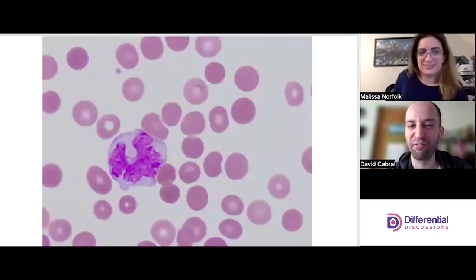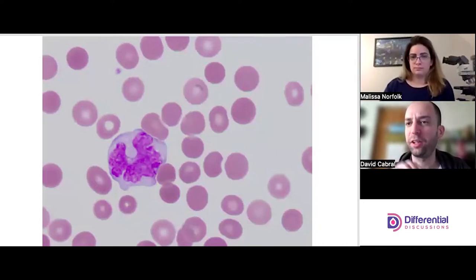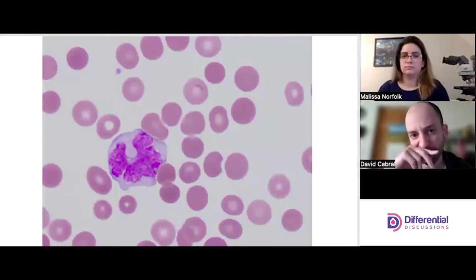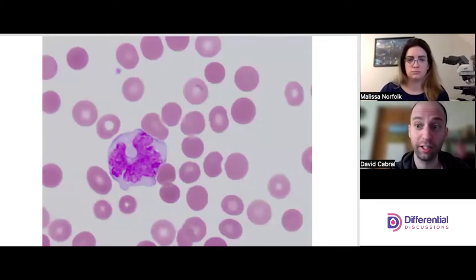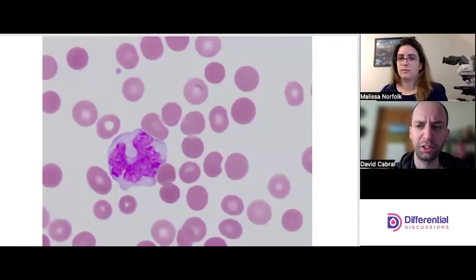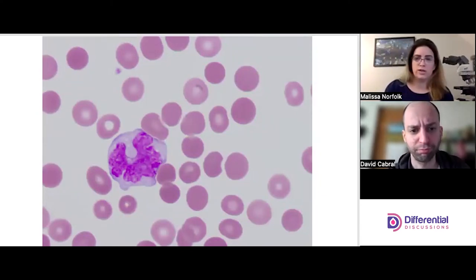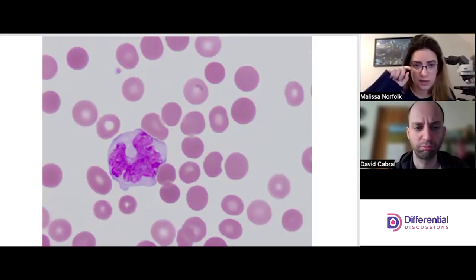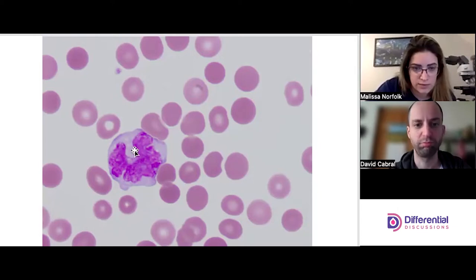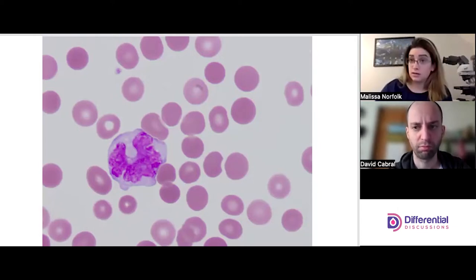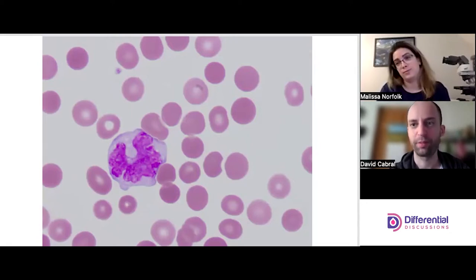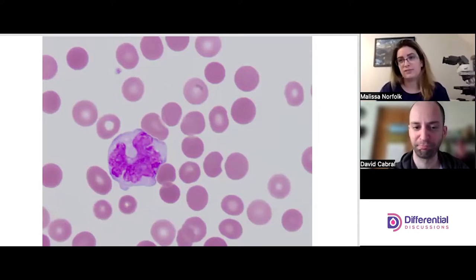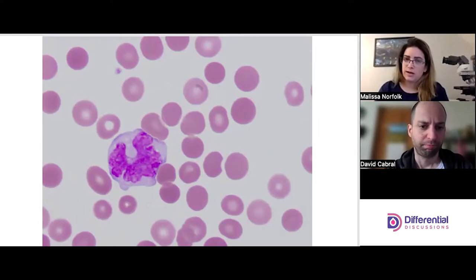Let's look at our first picture. First thing I'll point out is nucleus shape. Things that stick out to me: I'm looking at the cytoplasm color — not just that it's blue, but the shade of blue. It's got a bluish-grayish color. It looks like there might be a couple of vacuoles right in this area. Vacuoles are not unique to any particular cell, although you more frequently find them in monocytes than other cells.